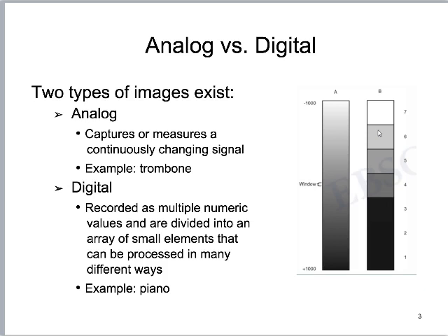Looking at that little tiny pixelated skeleton, we can see there's very little diagnostic value on that last slide. Not a lot can be looked at and diagnosed from that. So the question is, how do we get something better than a little pixelated skeleton? That's the question of spatial resolution.